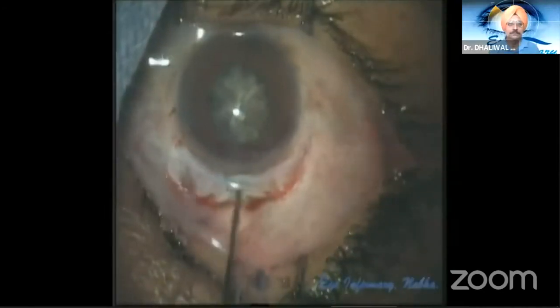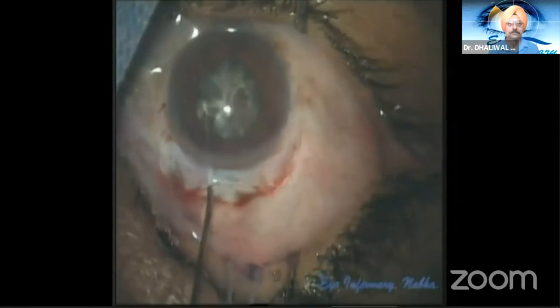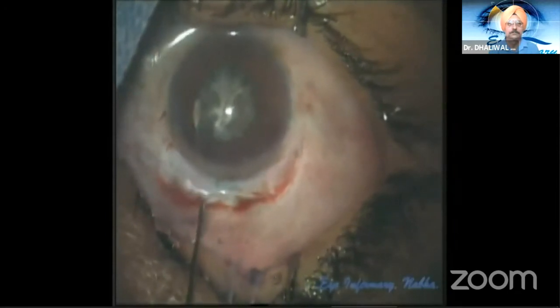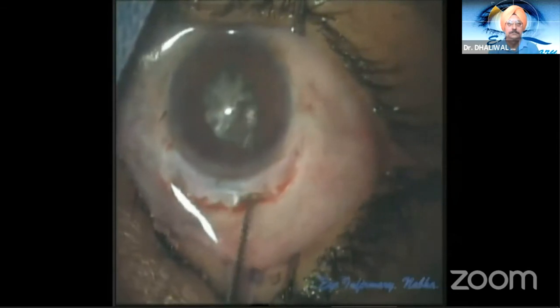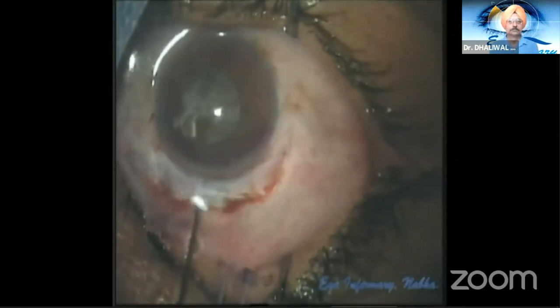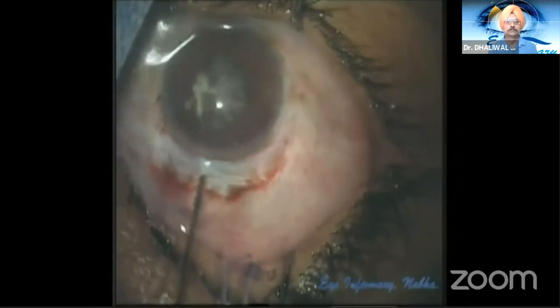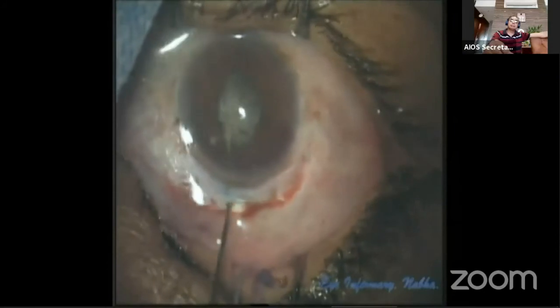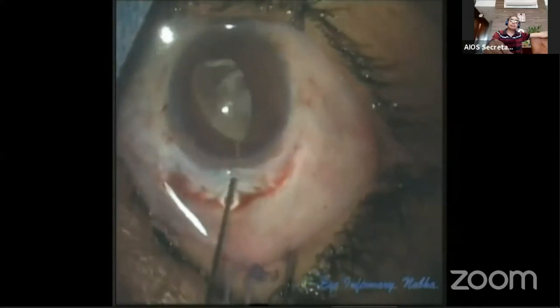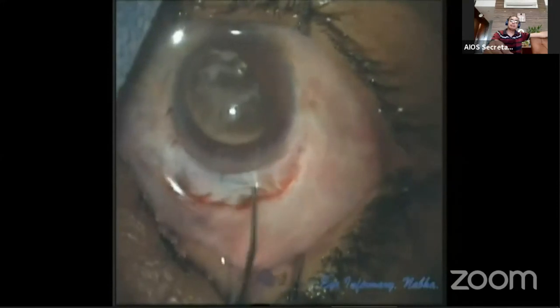Now the same procedure is demonstrated in slow motion. A gentle hydrodissection is performed with a 26-gauge cannula, and the nucleus is tapped on the opposite side to release the trapped fluid. With a slight curvilinear movement of the cannula, the nucleus is released off any adhesions with the cortico-capsular covering. The same cannula is then used to flip and tumble the nucleus out of the bag partially into the AC.